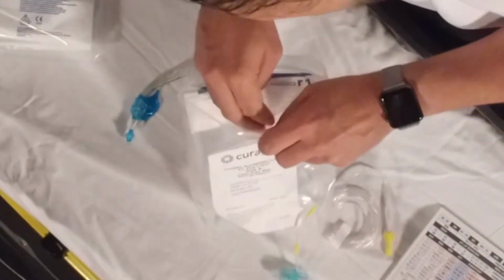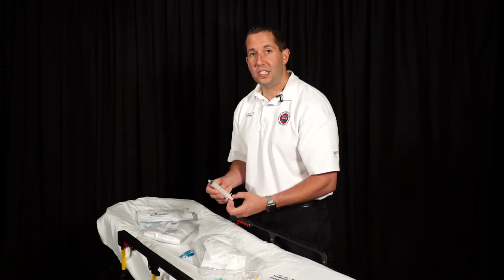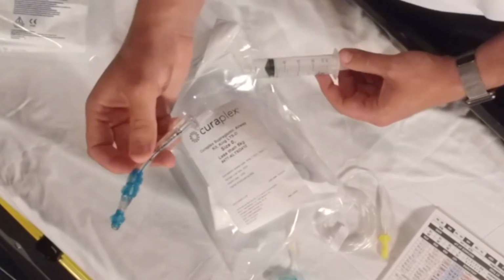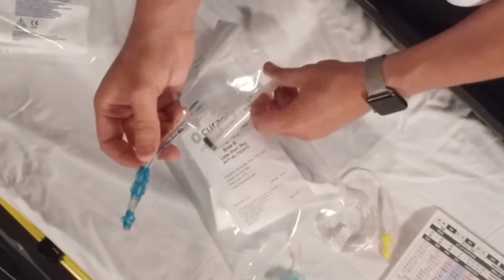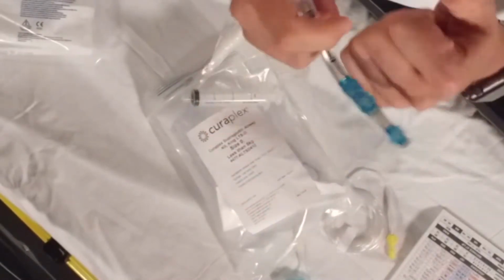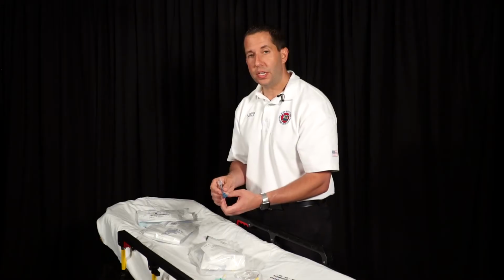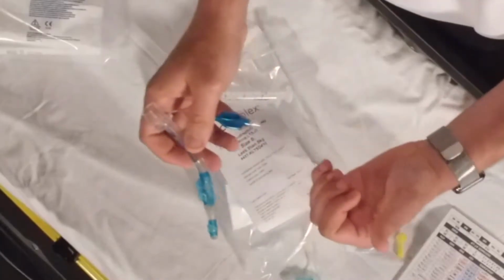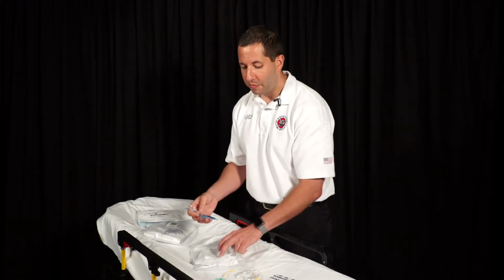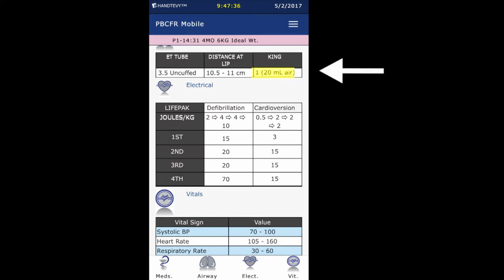Okay? It's going to come with a 25 cc syringe, so you want to make sure that you only inflate this to 10 cc's of air. Okay, because what we found out, the studies have shown the excess air that's in the inflation cuff pushes outward on the carotid arteries, decreasing carotid blood flow to the brain due to overinflation. So you want to make sure that you utilize this in the proper form and fashion. So the app is going to tell you what size King Airway as well as the inflation rate.